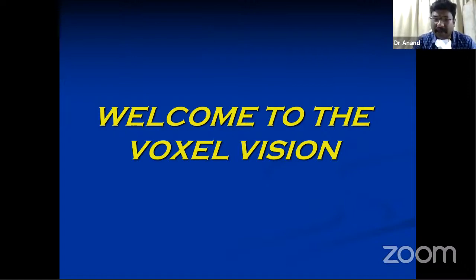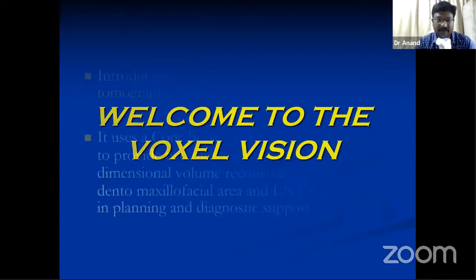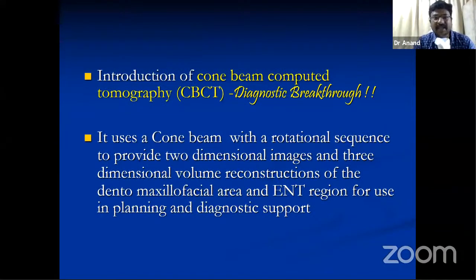Then came the cone beam computed tomography. This was specially designed for the dental and ENT field. With that introduction, I consider the introduction of cone beam computed tomography into dental imagology a diagnostic breakthrough. Here, it is nothing but a cone beam with a rotational sequence to provide two-dimensional images. It produces only two-dimensional images, and with them, three-dimensional volume reconstructions of the dentomaxillofacial area take place. From the two-dimensional images, you run certain algorithms, and from the algorithms, the transformation occurs to produce the three-dimensional imaging variant.